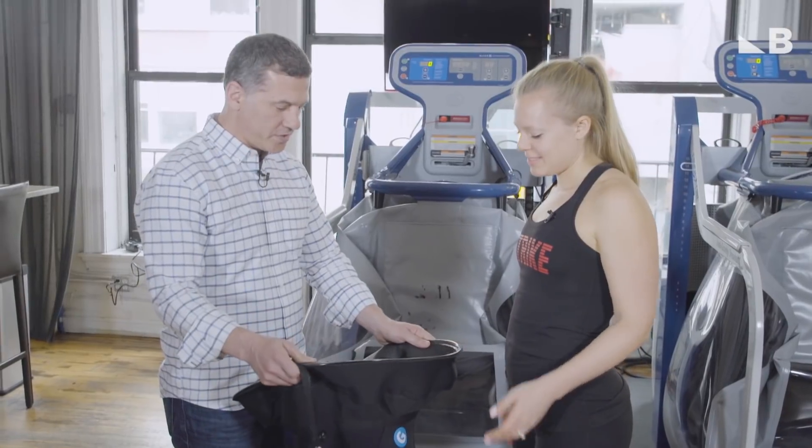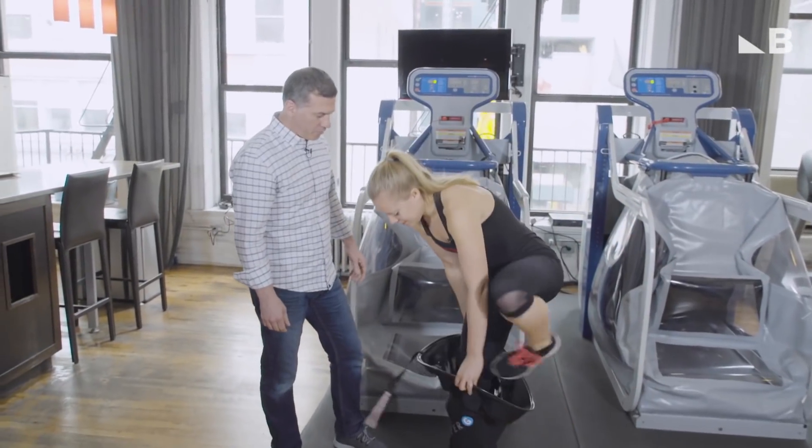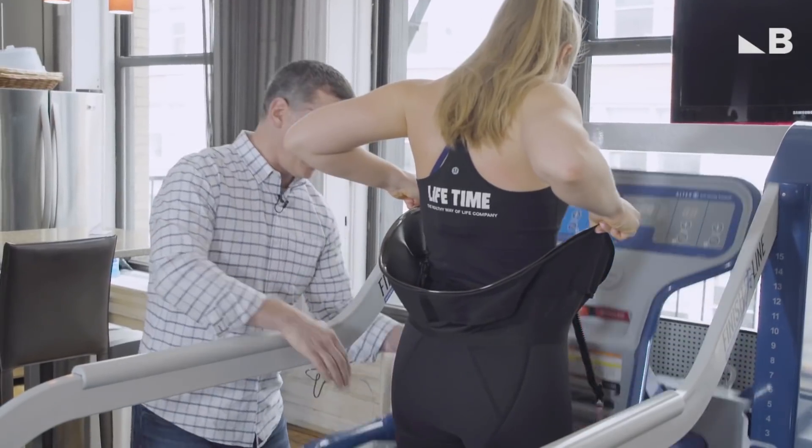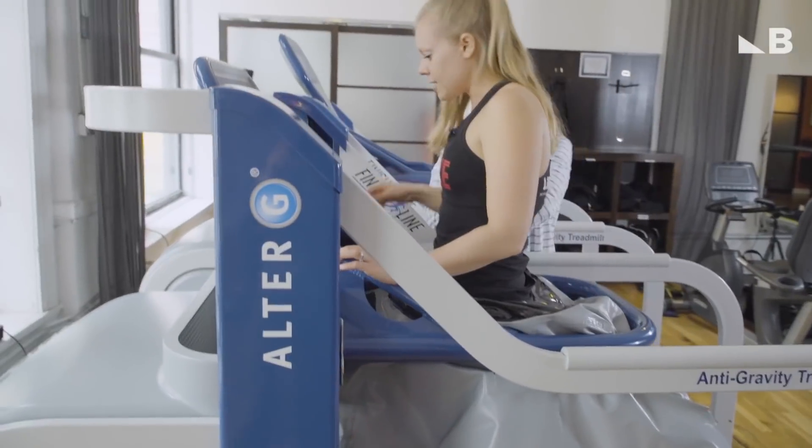So these are the shorts that you're going to use to run the Alter-G today — try to pull them up as high around your waist as you can. I'm going to bring this up. Guess I'm stuck now.